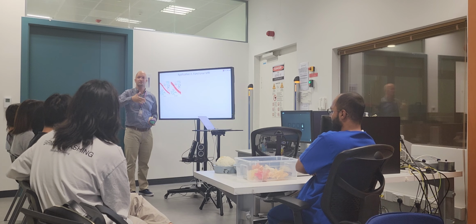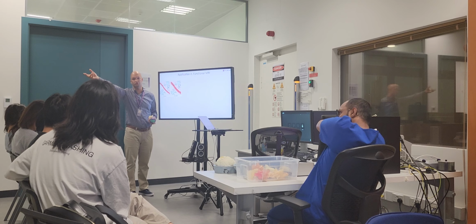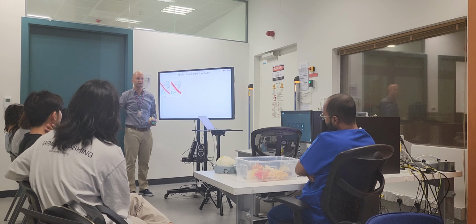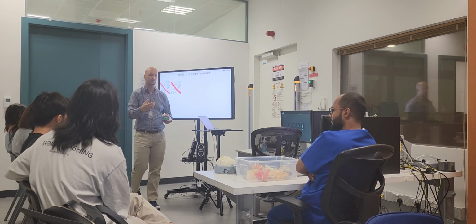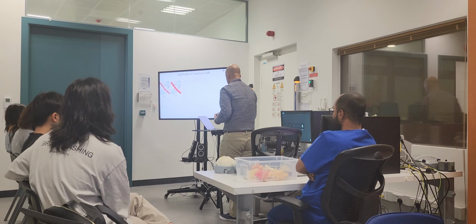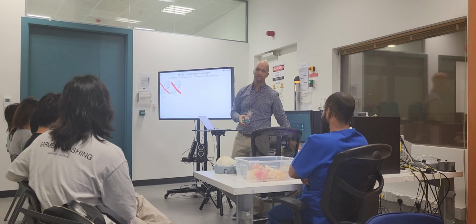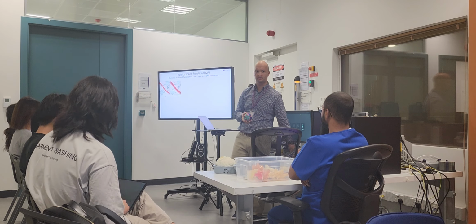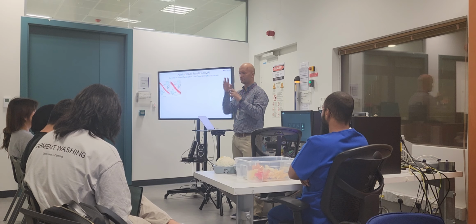T2 star happens usually after the first echo, because it decays very fast. The 180 degree pulse compensates the T2 star and you're studying T2. So T2 star is like a fast thing. It's very sensitive to susceptibility changes, and that's from deoxygenated blood to oxygenated blood. The commercial name of that sequence in MRI literature is called BOLD. Blood oxygenation level dependent is nothing but a T2 star gradient echo sequence. You studied gradient echo? It's essentially pulse acquire with some gradients to do imaging.